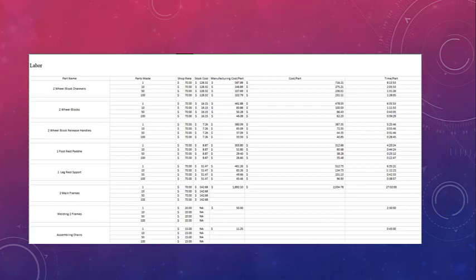Most of my parts were able to be plugged into the SolidWorks costing application to determine the nitty-gritty details of the labor associated with my chair. As seen pictured here, all parts with the exception of my frame are here accommodated for different quantities produced. Due to a lack of resources during this time of quarantine, I was not able to fully put together a detailed labor list like the previous parts for my frame. I was able to, however, determine the price per one set of frames, as well as a ballpark cost for the cost of a welder and an assembler to put my chair together.